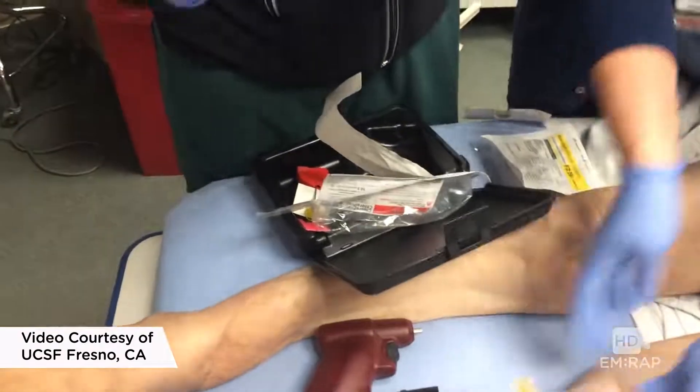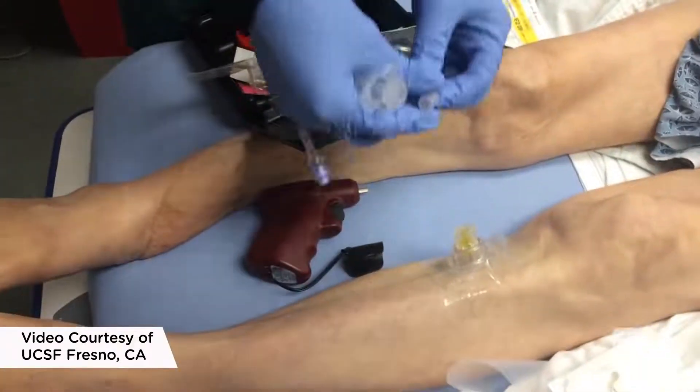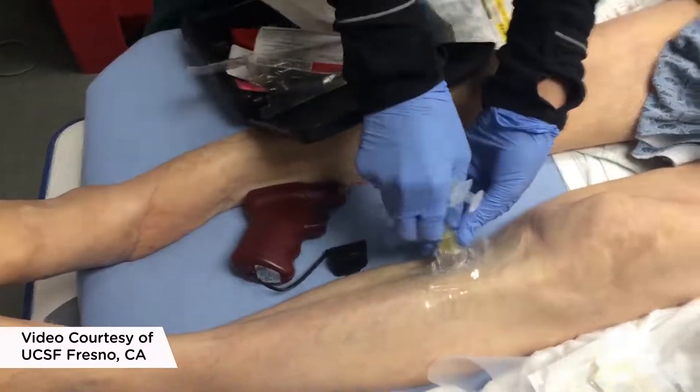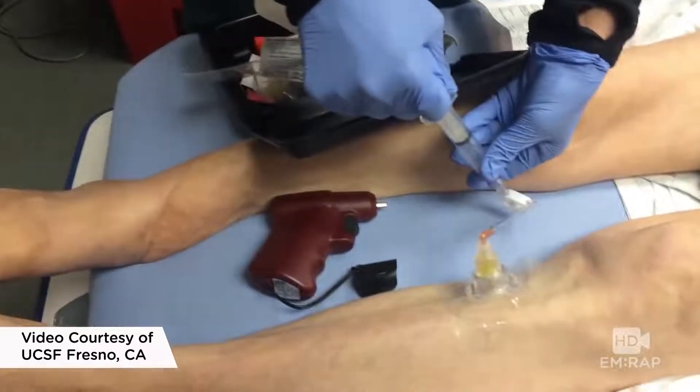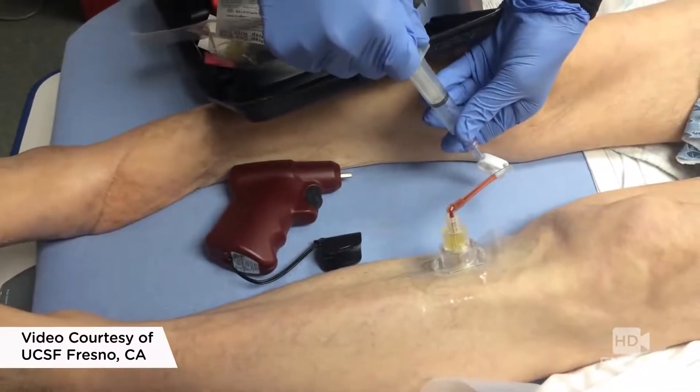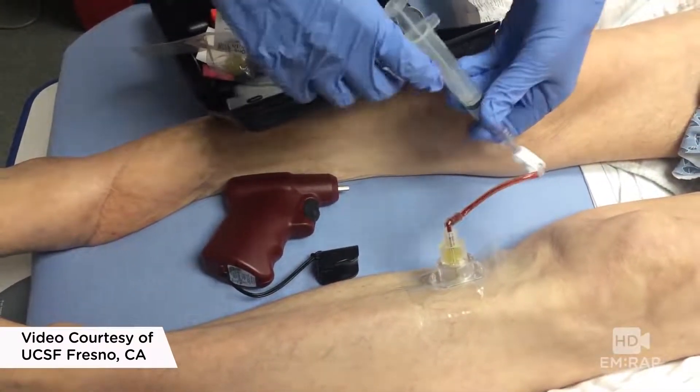They're going to draw off some labs here, which is great for things like H&H and type and screen, but some elements of your chemistry panel are going to be very different from your serum levels, so you want to be careful. And remember, you can give any medication through an IO line.